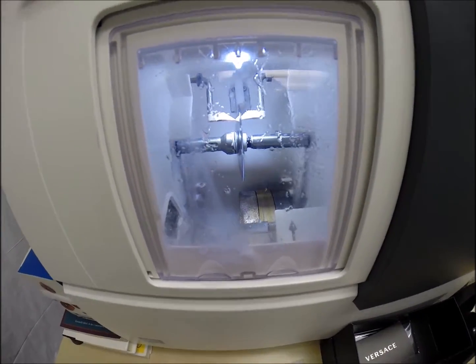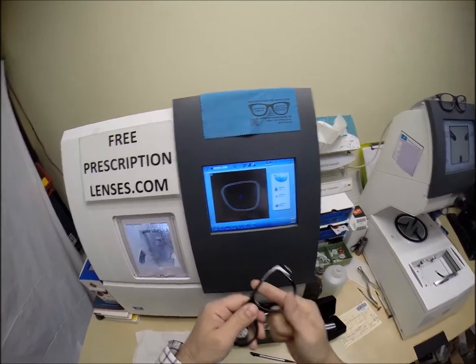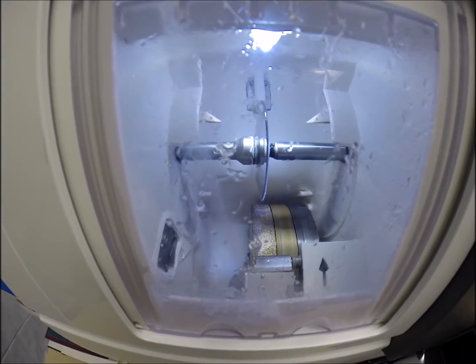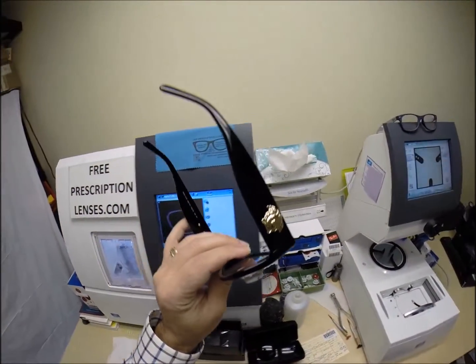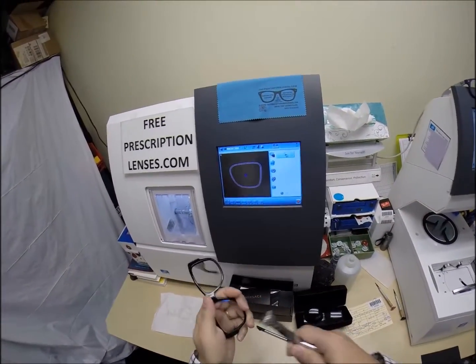And you can see as it's tracing the shape of the lens as it's going around doing the left. And just like before, it's measuring the thickness of the lens at every point to know exactly precisely where to place the bevel, so you have the least amount of edge thickness showing, of which you got none. You hear that, Hightower? You got nothing. No edge thickness whatsoever. So while the left is cutting, I can go ahead and start working on the right.